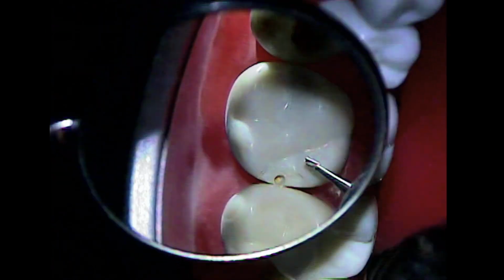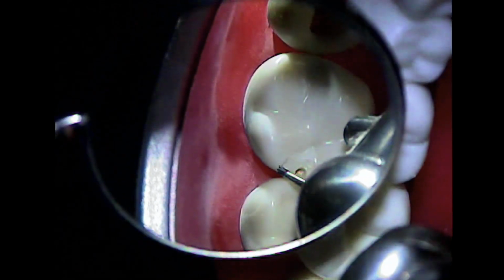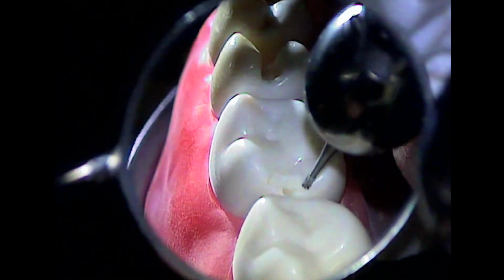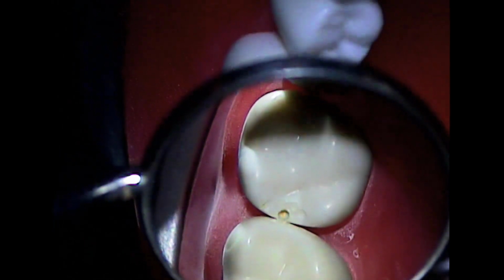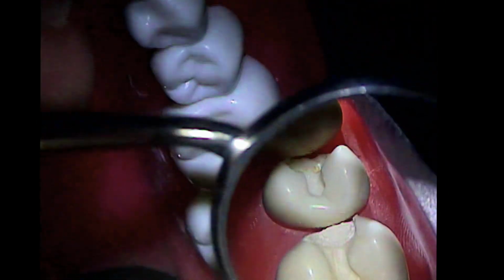So work at this depth right here as you go facial and lingually. If you have really shallow walls, it's super easy to overextend. Because just a little slip and it cuts beyond the little short wall that you have. If you make it taller and you slip and you hit the wall, it doesn't cut. So you won't slip and overextend. So anyway, continue with that one.